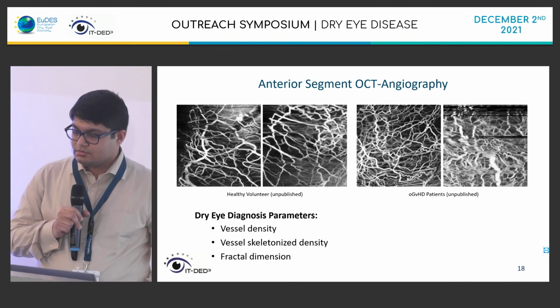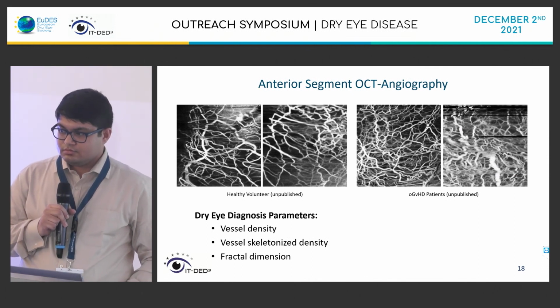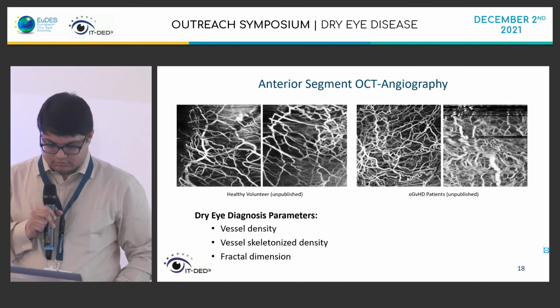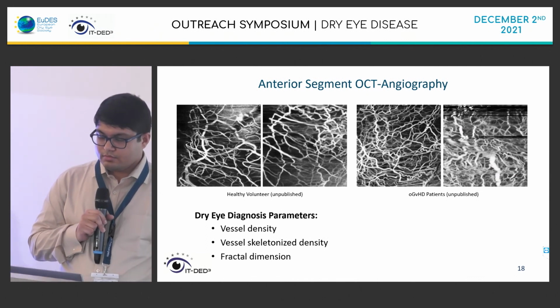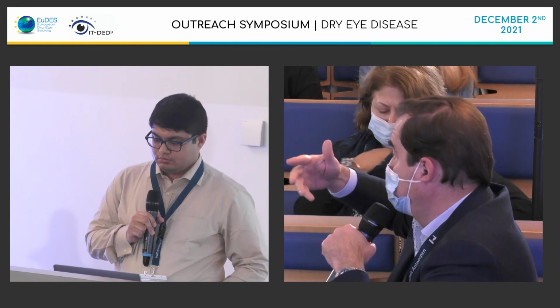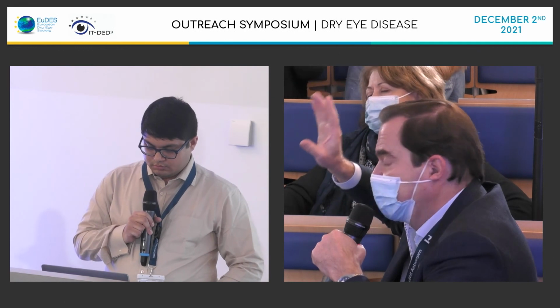And the answer is in fact based on the principle of angio-OCT. I'm not sure everybody is aware of the technology, because what we are observing is based on movement. Angio-OCT is a system where all structures that are in movement are transformed into white lines or pixels.